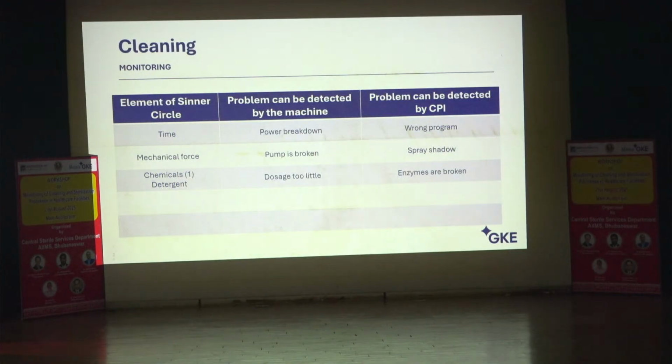How can it happen in real life? Well, so many reasons. The first thing is that your machine does not do a dosage which is correct. Very modern machines can monitor that. They will say, dosage was incorrect, I did not put enough milliliters in your cycle. But what about the enzymes in your detergent? You remember what I told you?